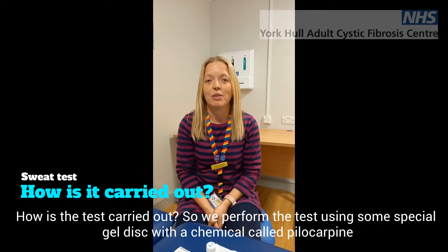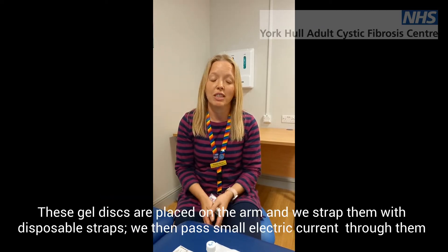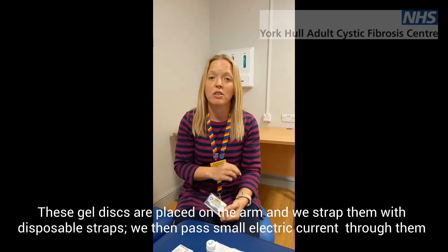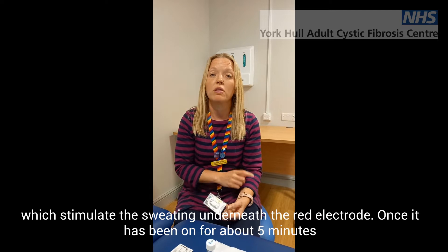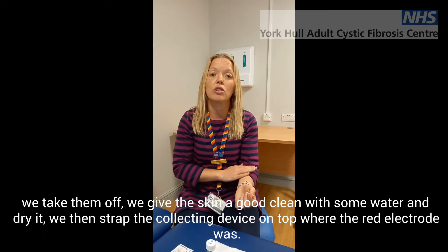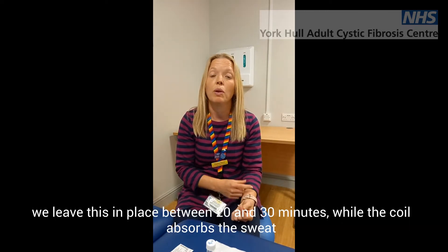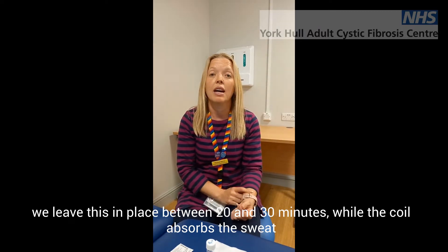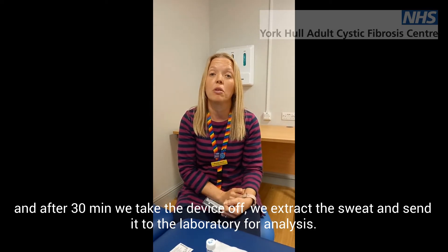How is the test carried out? We perform the test using some special gel discs with a chemical called pilocarpine. These gel discs are placed on the arm and we strap them in place with disposable straps. We then pass a small electric current through them, which stimulates the sweating underneath the red electrode. Once it's been on for about five minutes, we take them off, give the skin a good clean with water and dry it, then strap a collecting device on top of where the red electrode was. We leave this in place for between 20 and 30 minutes while the coil absorbs the sweat, after which we extract the sweat and send it to the laboratory for analysis.